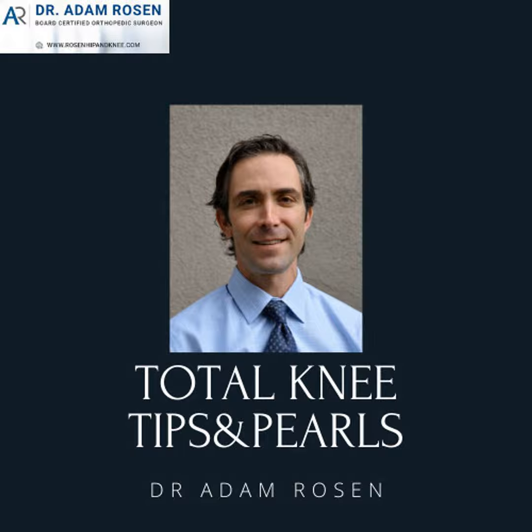You can use an offset punch and basically knock it off from above. But you do not hit it as hard as you can. So if it started to come off, you can hit it and tap it. If it starts to move, that's great. It should come off easy. But if you start to hit it and it's stuck on one side or the other, it starts to hinge into varus or valgus, just know that you're still adherent on one side or the other. So instead of hitting it harder, go back and work that side which is still attached to bone and try to preserve as much bone as possible.